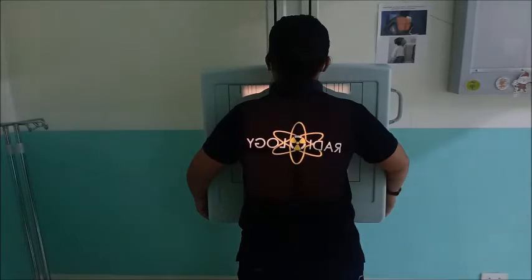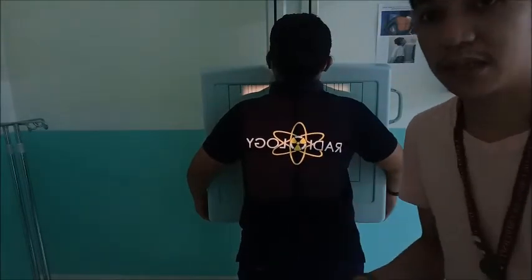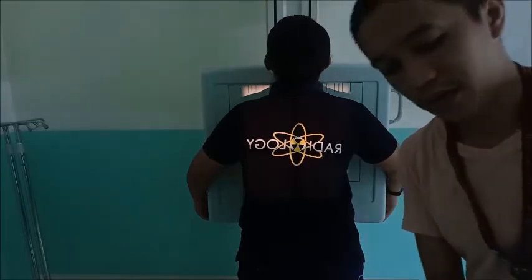So again, it will depend on the body habitus of the patient. Again, this vertical line is on the vertebral column of the patient. That's why when the patient wears a gown, the opening is at the back. One of the purposes is to see the line of the vertebrae. And then for male patients, the most common practice is to have them go bare-chested, but some male patients would sometimes request to wear a patient's gown.